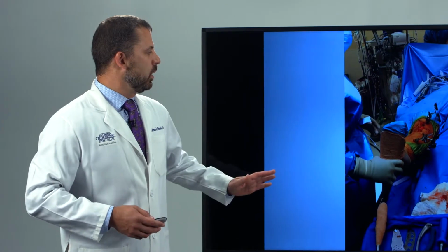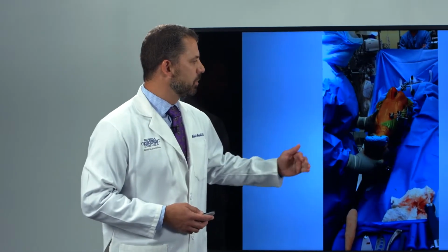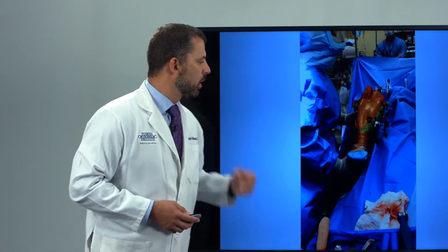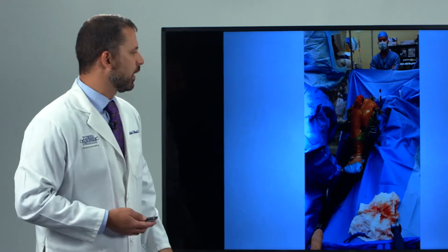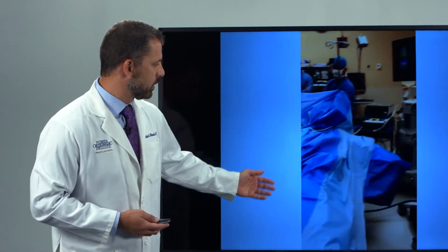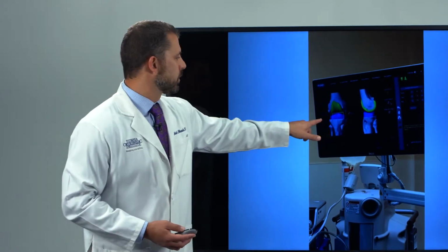So then we're done. We still evaluate the knee, see how it feels, take it through a range of motion, bend the knee up. Does the patella track well? We get full flexion there, probably 135 degrees, and full extension. And then when we move the knee around, we can see, does it remain well balanced?